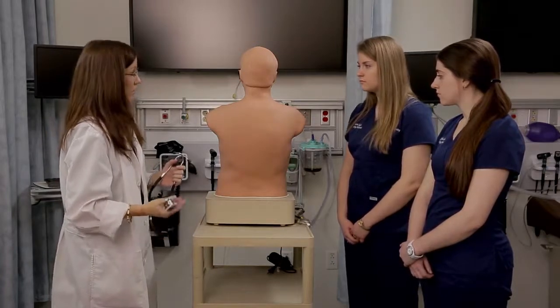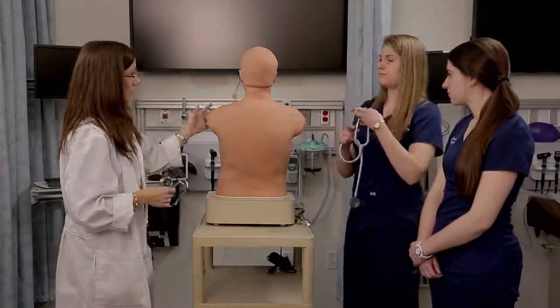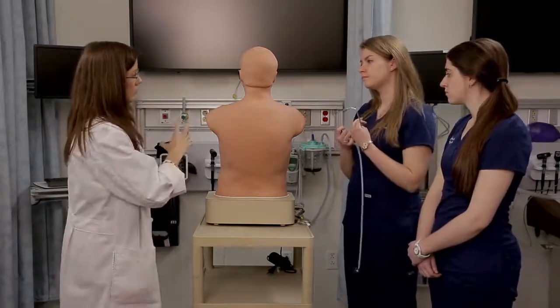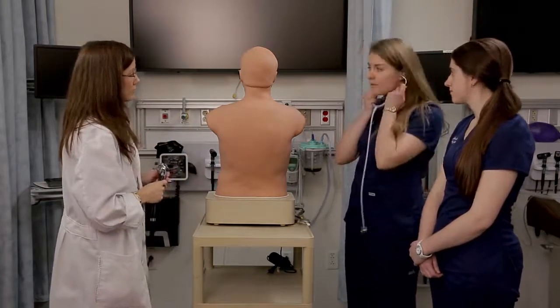So let's start, Naomi, maybe by having you take a listen. Our mannequin can actually demonstrate some of the sounds. So as you listen, I'll have you listen first to what normal breath sounds would sound like.